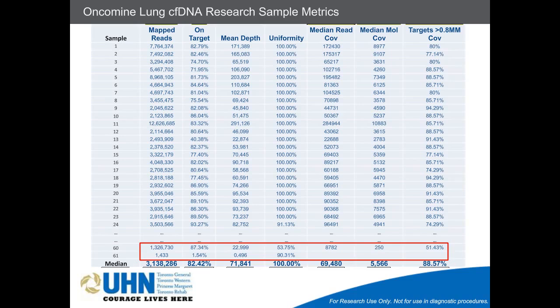were met or exceeded what was recommended. I did highlight at the bottom 2 samples, one of which failed, which I called 61 in this slide, and then one which was suboptimal, so didn't quite meet the metrics that we would have expected or that the other samples met. But still, the data from that sample was still quite reliable in comparison to ddPCR.